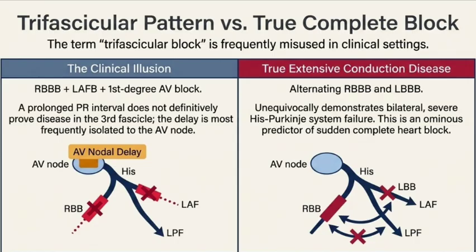Yes, and finding that active heart attack becomes the clinician's biggest challenge. When a bundle branch blocks, especially the left bundle, the right and left ventricles lose their synchronized timing. They fire totally out of sync. Okay. This creates a massive, wide, chaotic electrical collision on the ECG paper, and that chaos can completely hide the subtle ST segment changes that normally warn a doctor about a heart attack.